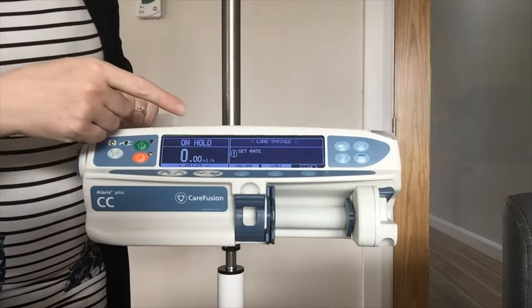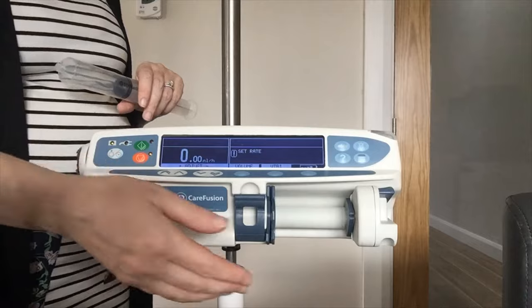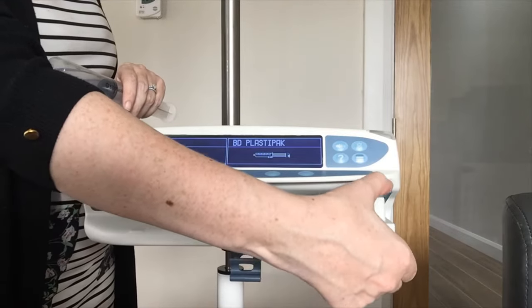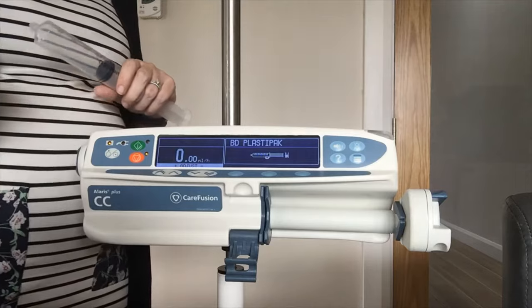On screen now it is telling me to load my syringe. To load the syringe I am going to bring my clamp down and bring back my drive which holds the plunger. To bring back the drive I am just going to pull on the lever fully with my thumb and bring that back out of the way, leaving room for my syringe.